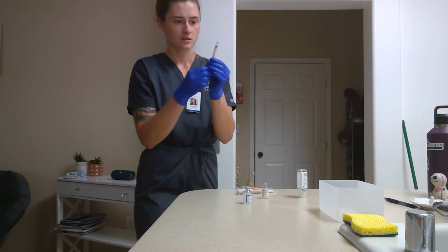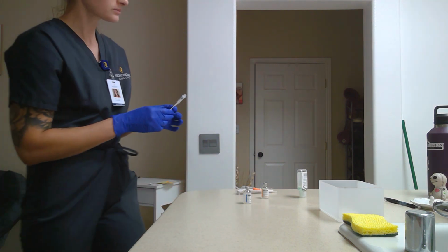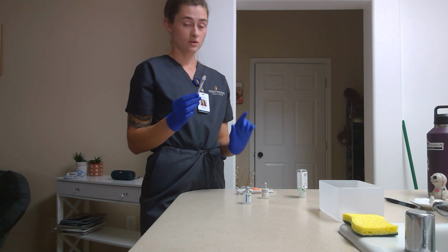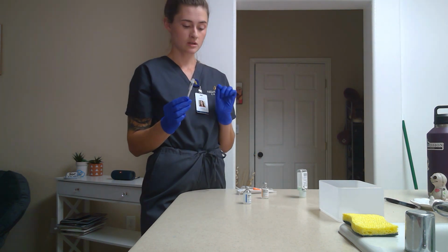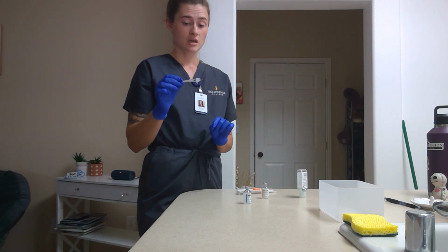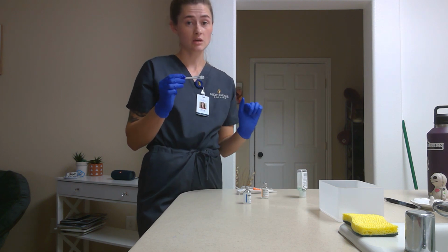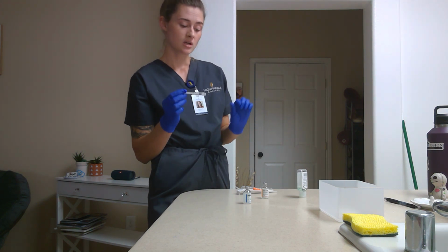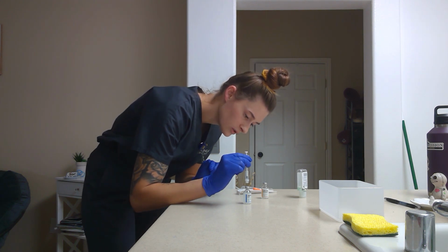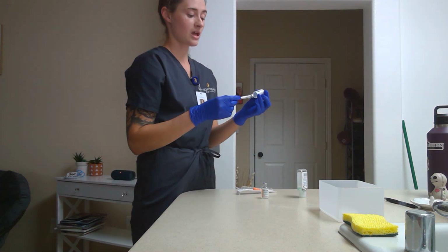Perfect. So I'm just going to show you here. I have 4 units. Okay, now that I have the 4 units of the regular insulin, which is the clear, now I'm going to be injecting it into my NPH and making sure I'm not mixing the regular into the NPH. You don't want any to eject. We are just simply putting it into the NPH vial and drawing back exactly 8 units.